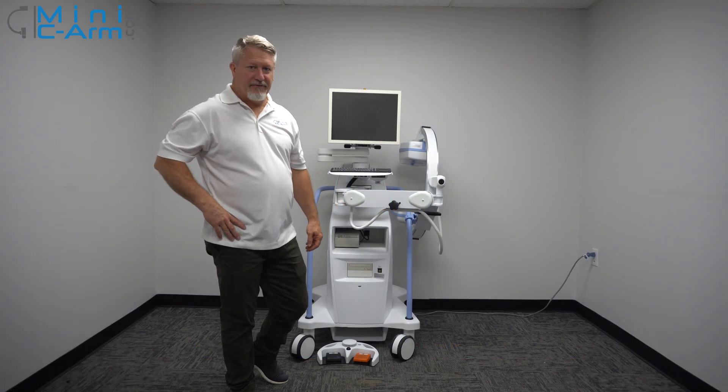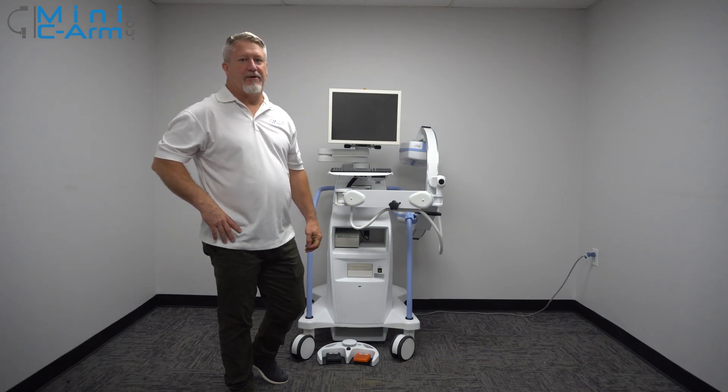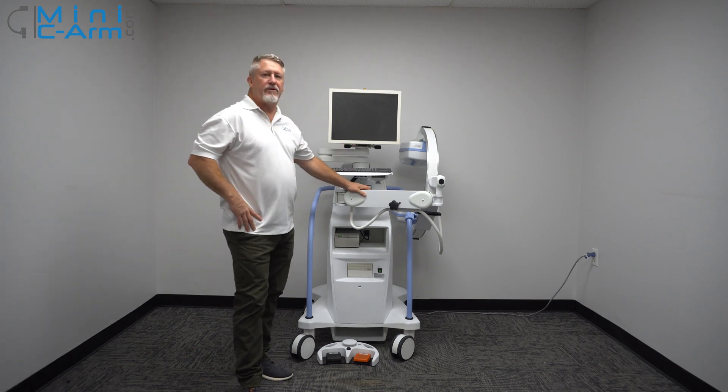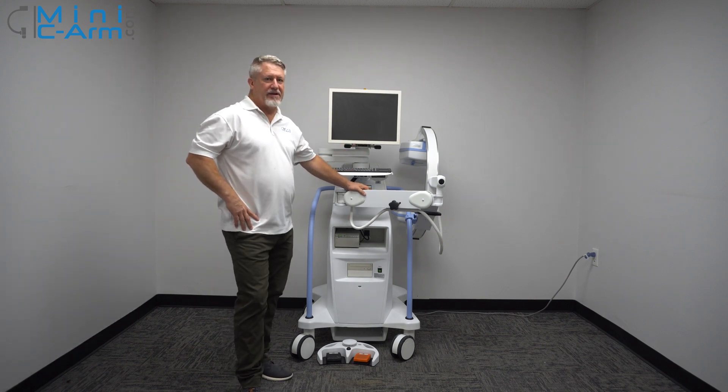Hey guys, I'm Christopher Bacon. I'm the founder of OrthoScan and the president of MiniC-Arm.com. Today we want to show you how to basically use the Hologic Insight FD.